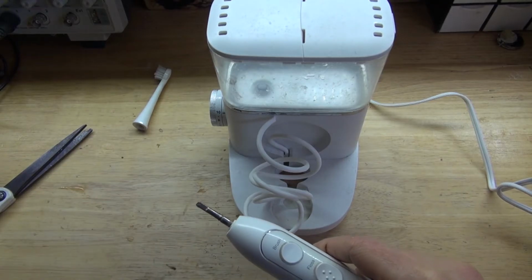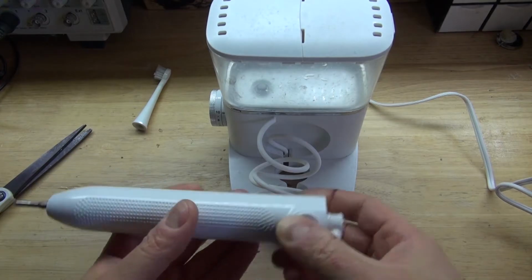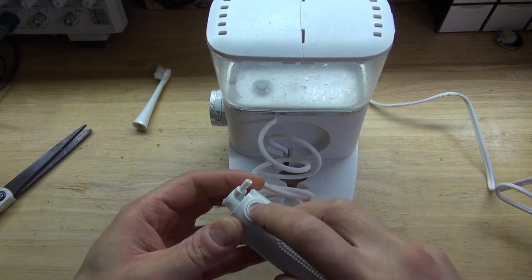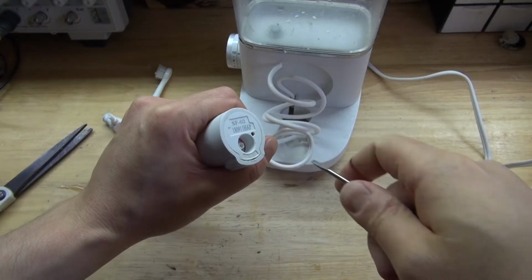Has a little bit of grease on it, so that's normal. Oh wait, I guess I should have pushed this button. Whoops. Well, if I pushed this button it would have been a lot easier. Oh well, just simply push the button and it comes out just like this. And now let's go a little deeper.